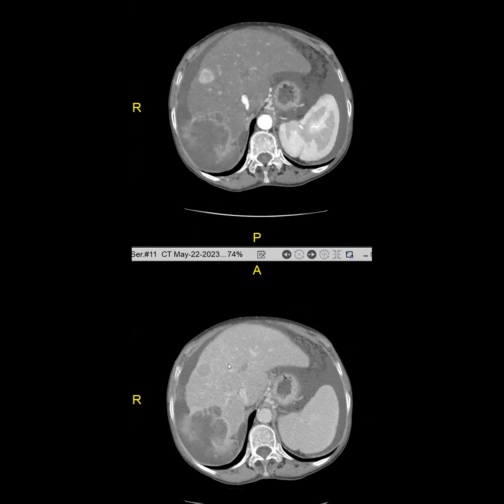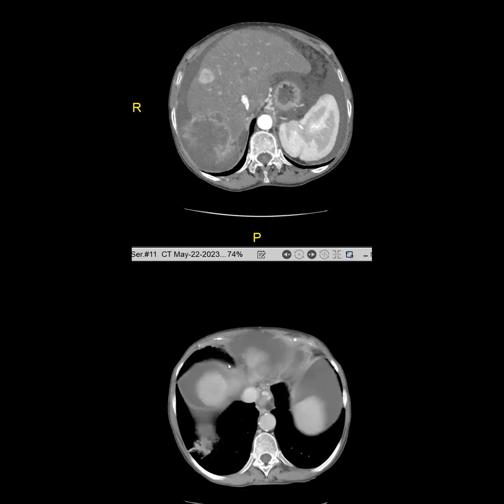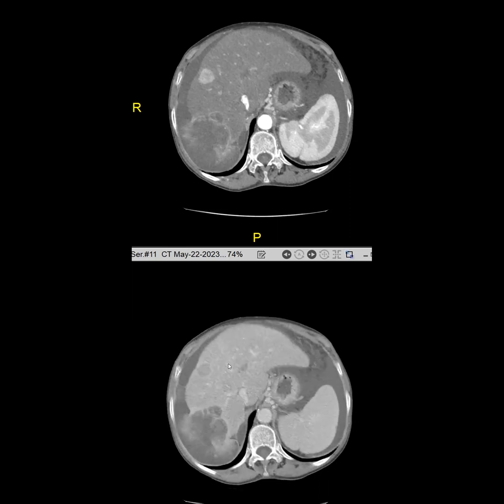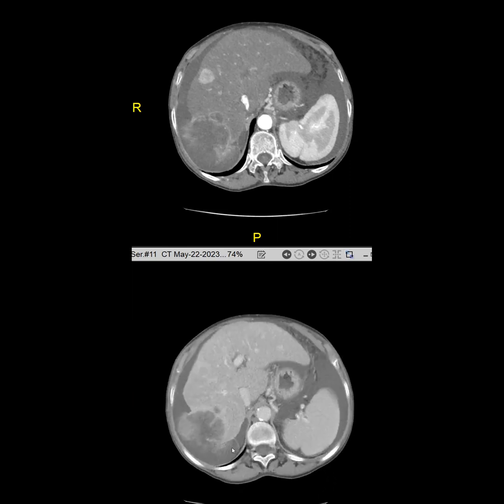Can they be mets? This is like an odds game. We had this conversation with the clinicians today. The likelihood ratio for LR-5 category is fairly high — it's about 17 — which means HCC is 17 times more likely to meet criteria for LR-5 than non-HCC. So the odds are these two lesions are HCCs. The patient clearly has cirrhosis, so she's at risk for it, and they don't look like this big rhabdomyosarcoma.